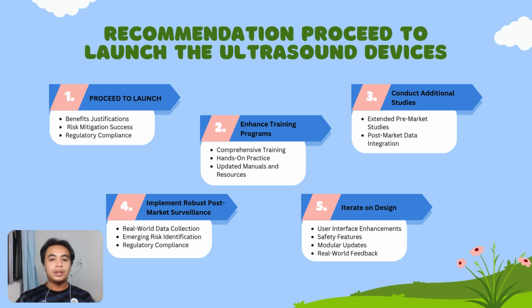Lastly, iterate on design. Use feedback from PMS to continuously refine and enhance the device post-launch. Focus areas include user interface enhancements, streamlining control and display for intuitive use; safety features, adding safeguards such as automated shut-off for prolonged exposure; modular design, add-ons or upgrades that can be easily integrated to expand functionality without significant overhaul; and real-world feedback, engaging directly with clinicians and patients to prioritize updates based on their experience.